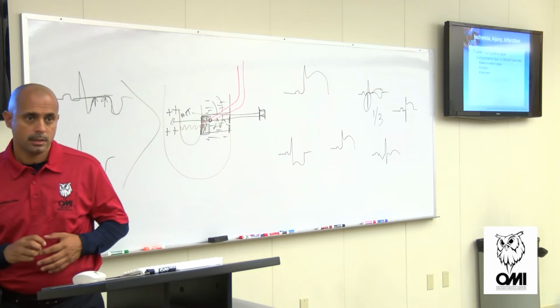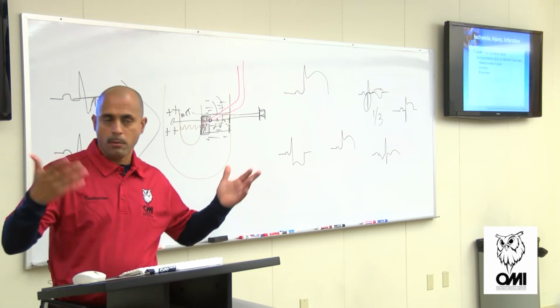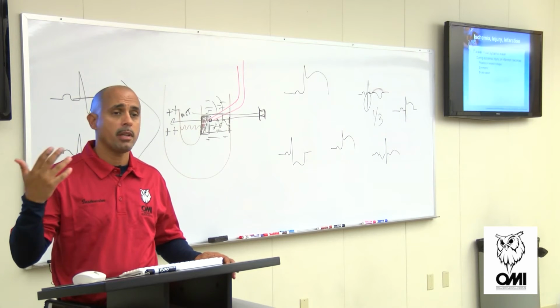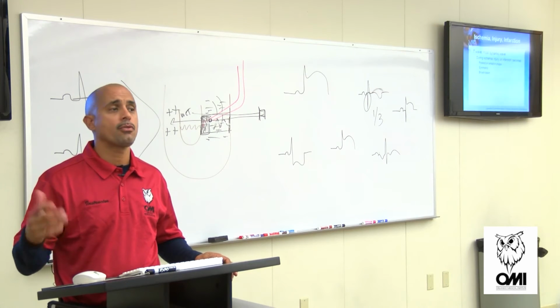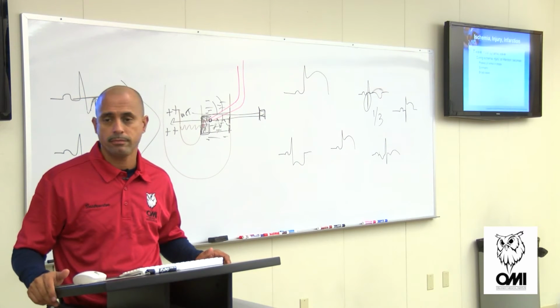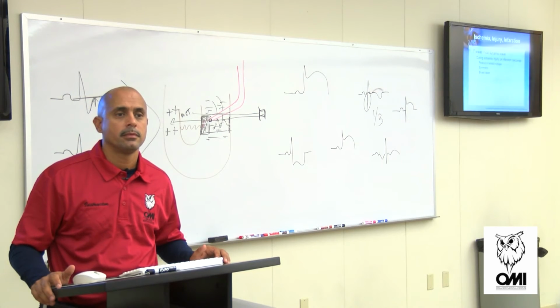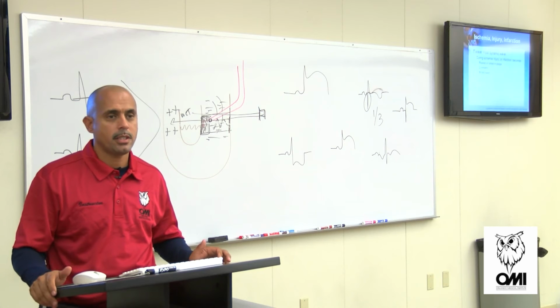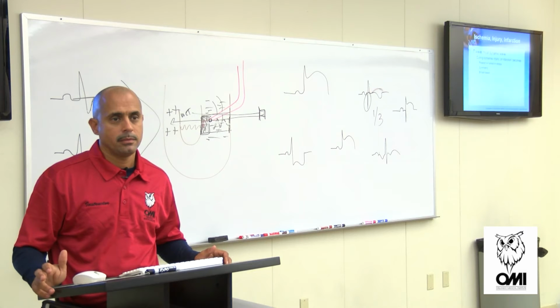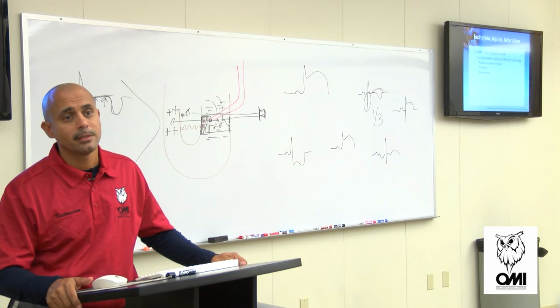How do you call it in a radio report, like ST depression? Just like I would call the age, the name, all that stuff, and I'll just say, 25-year-old male complaining of chest pain, or 25-year-old STEMI alert showing ST elevation in 2, 3, aVF. Anytime having an inferior wall with elevation in 2, 3, aVF, blah, blah, blah. And tell them everything you've done. But the depression, you won't call anything on it? Why? It's a STEMI. Elevation. That's worse than depression? Yeah, that's what we call it.